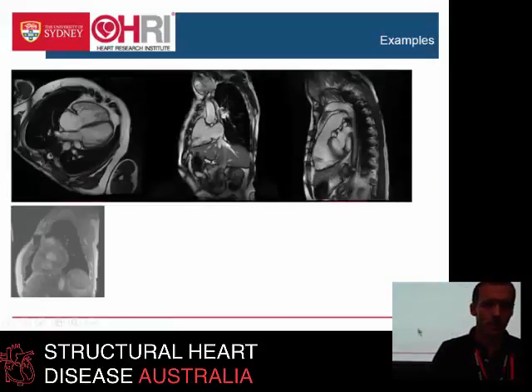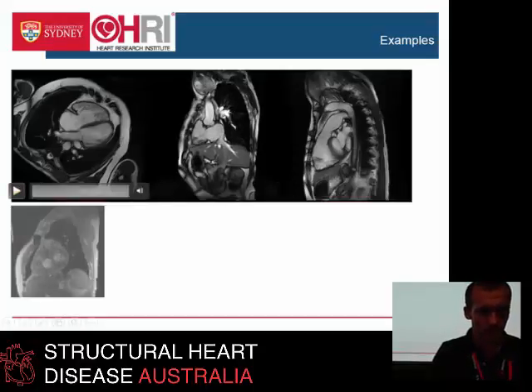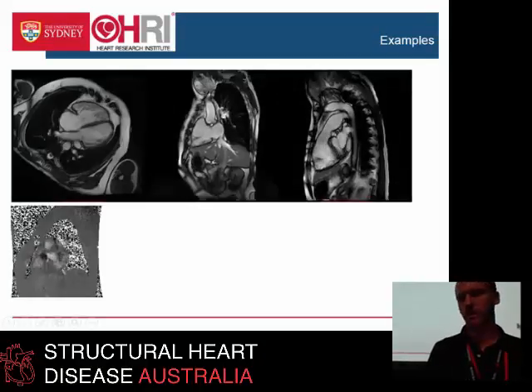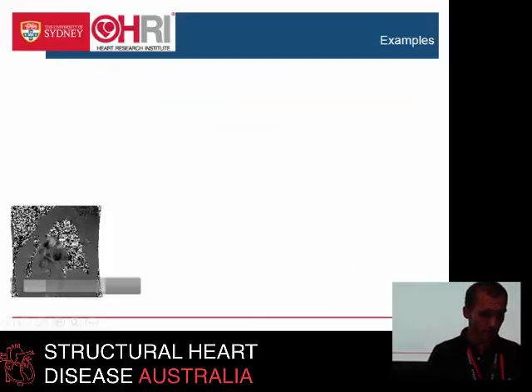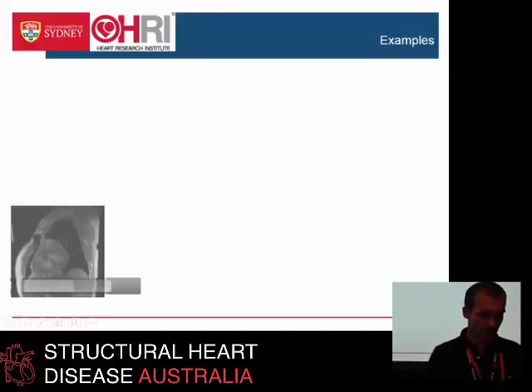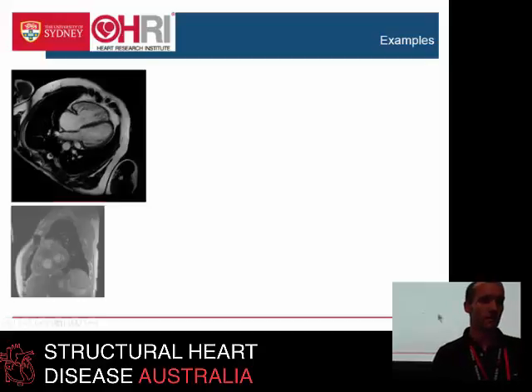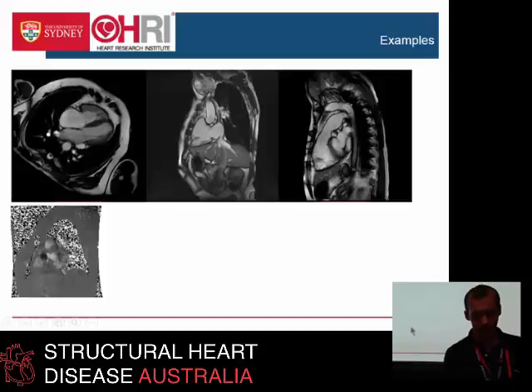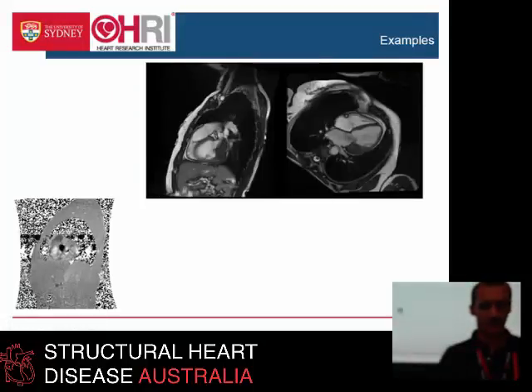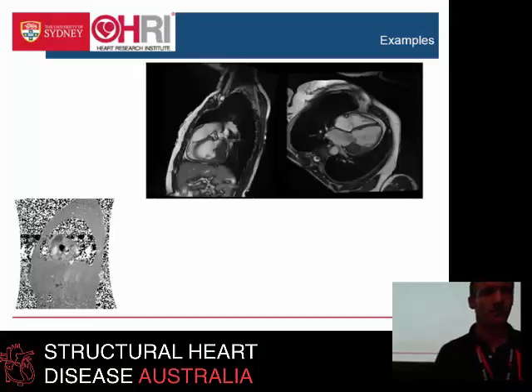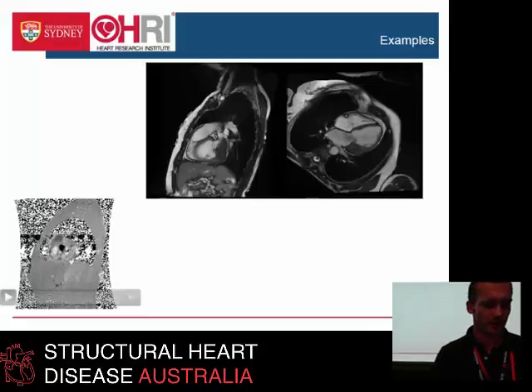Here are just a couple of random examples. This person's got a bit of dilatation in the pulmonary artery and some interesting flow patterns. You'd see some aortic stenosis there inadvertently viewed in the valve shot - I think it was 3 metres a second. This one here is actually a tumour in the base of the free wall of the left ventricle, which is obviously causing some mitral regurgitation. Interestingly in that flow, you could quite well see some MR and TR.